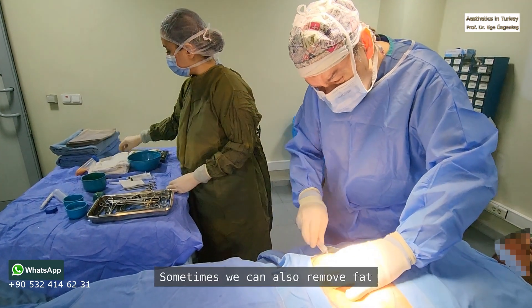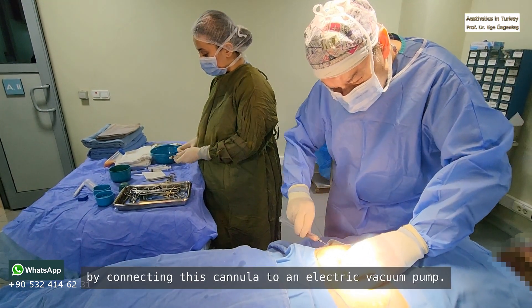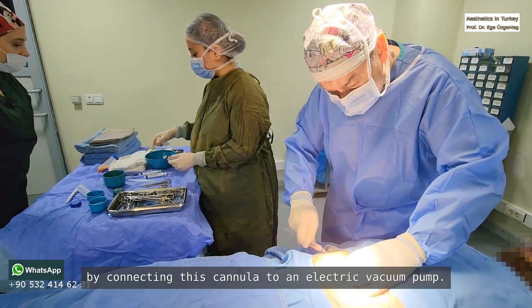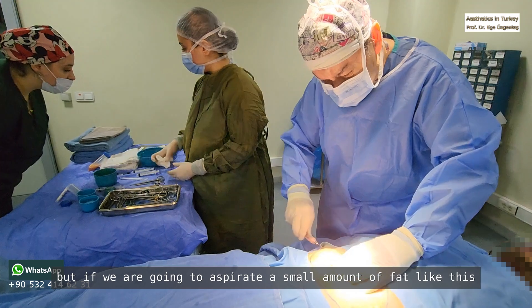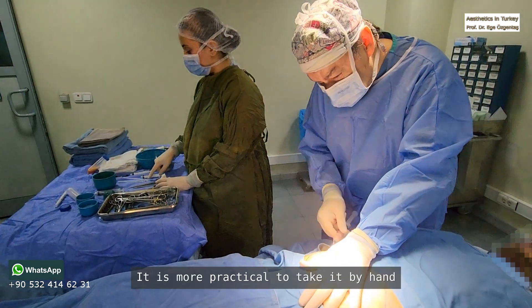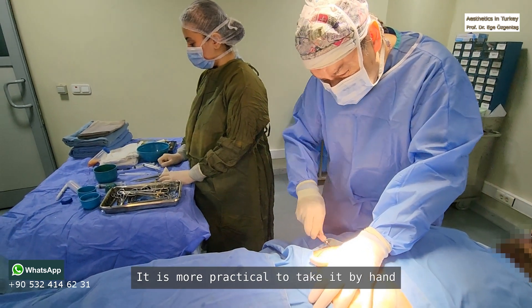Sometimes we can also remove fat by connecting this cannula to an electric vacuum pump. But if we are going to aspirate a small amount of fat like this, it's not worth it. It is more practical to take it by hand.